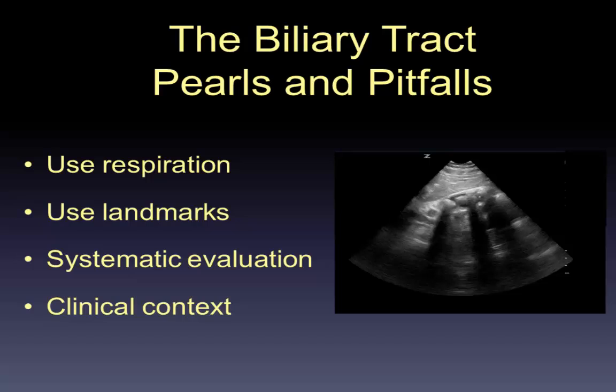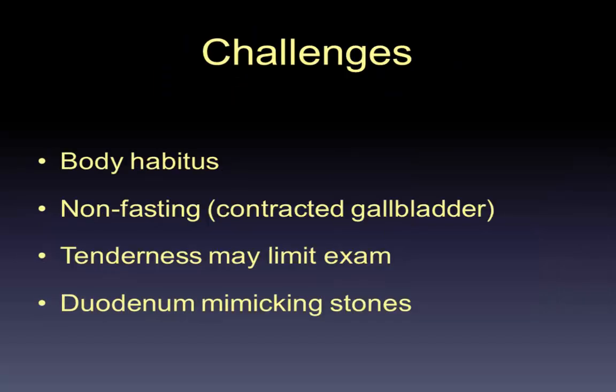wider clinical context. Remember, a lot of patients have asymptomatic gallstones, and so there might be other pathology actually causing their symptoms. And then conversely, there is biliary pathology that exists without sonographic abnormality. So if their symptoms fit and you still have clinical concern for biliary dysfunction, you may need to pursue further workup, maybe scintigraphy.